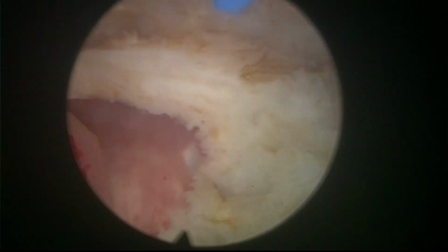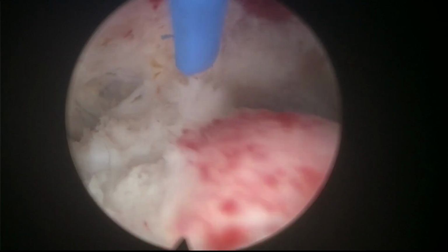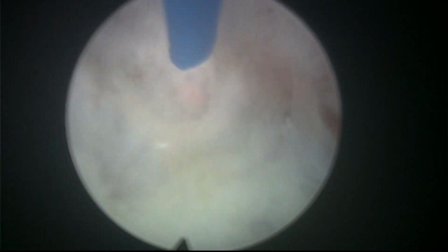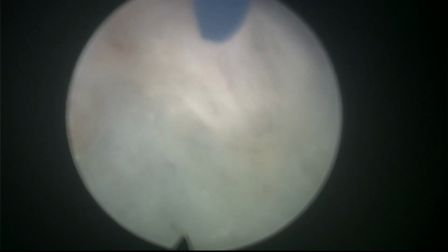This is the Quanta system laser with the pulse modulation at my current normal settings, which are 2 joules and 50 hertz. There you can see that sometimes the plane is not very clear. So you have to judge and do your best, and then at the end we'll have a look and see if there's any bump or any residual tissue.